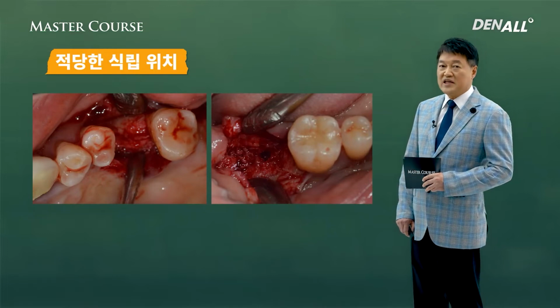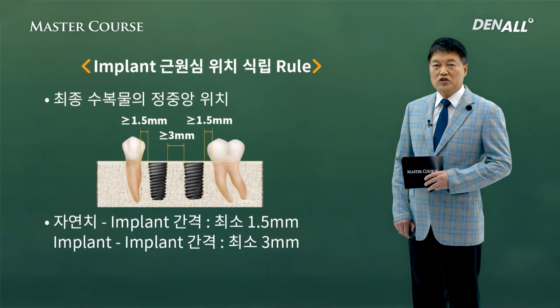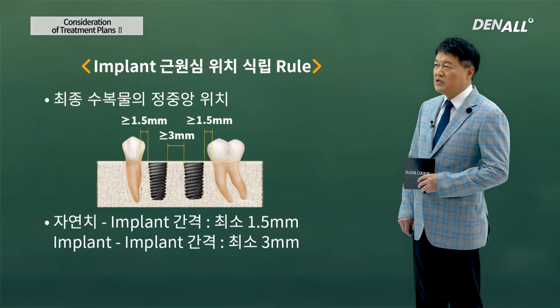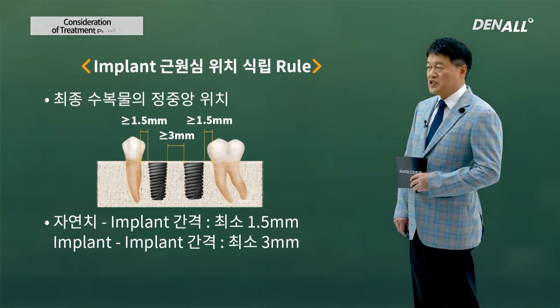Let's look at implant position. Implant position in terms of mesiodistal or buccolingual aspects need to be considered. Let's look at the principle for mesiodistal implant placement.